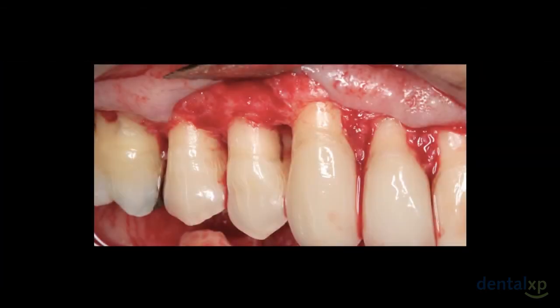A normal occurrence that every periodontist will tell you he finds is when you reflect tissue back, you can see a concavity filled with calculus. Again, this type of procedure to me, if we just remove the calculus and close the area up, would continue to progress over time. So when I do get into areas like this, I try to work on the line angles to remove them as best as possible, but I do not advise this type of technique. This is a very difficult technique and really truly doesn't accomplish what we want.